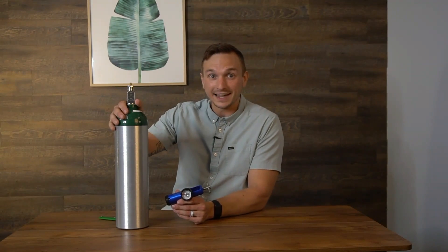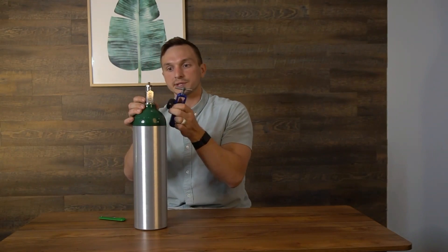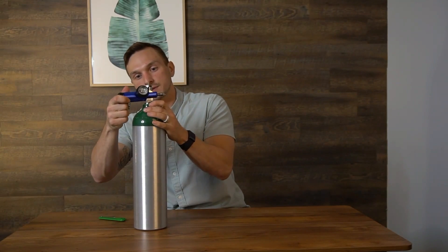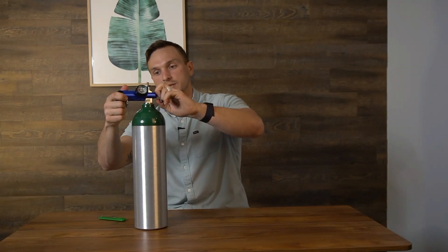Now I'll show you how to connect the 870 regulator onto the 870 oxygen tank — this one is a bit easier. There are two prongs on the regulator and two corresponding holes on the oxygen tank; the prongs go right into the holes. This one just requires finger tightening. Then open the valve on top — no oxygen will flow until both the valve is open and the regulator knob is set to something other than zero.